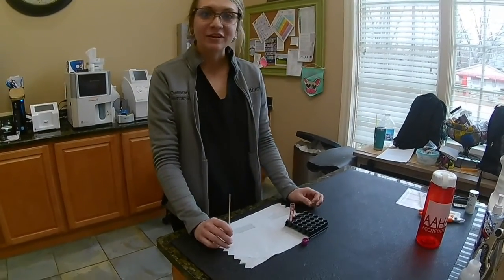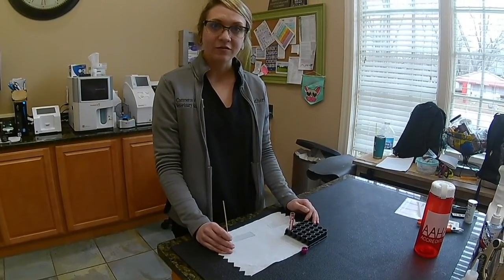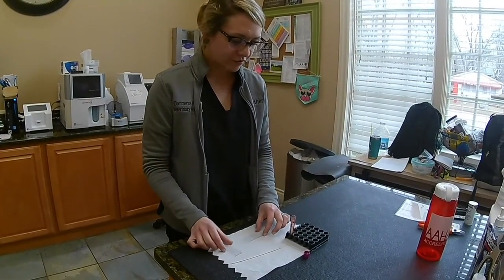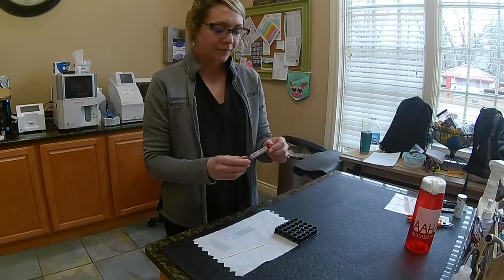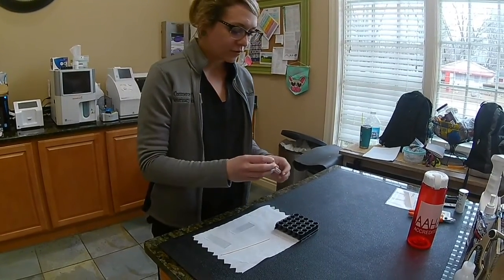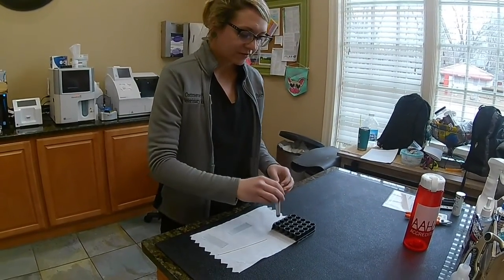Alright, my name is Heather Lieberman, and in this portion of my video, I'm going to be making the slide for my complete blood count. So to start, I need certain supplies. I have my lavender top tube with the blood that I had collected from Vader. So I'll be using that. I'm gently inverting it to mix up my sample.